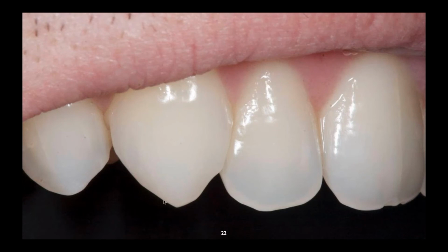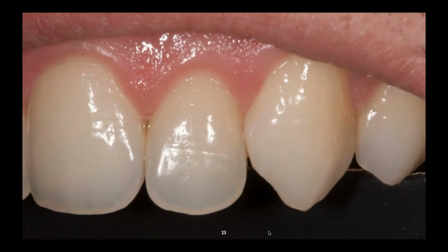Now, by looking at this, the only wear that this guy is developing is right on the incisal right here. He's chipped his own teeth. And so that has to be worked out when you're getting ready to place the bridge in the mouth. You've got to make sure the occlusion is right, etc.